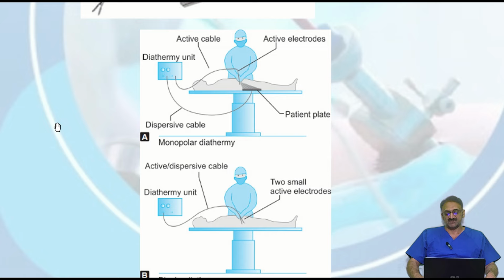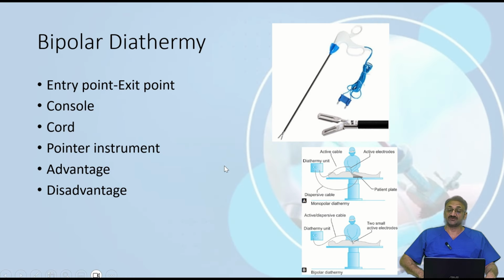However, in the bipolar diathermy, you can see that there is no earth plate required, and the current does not have to move through the whole body.